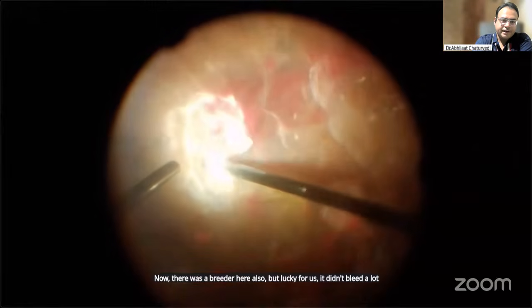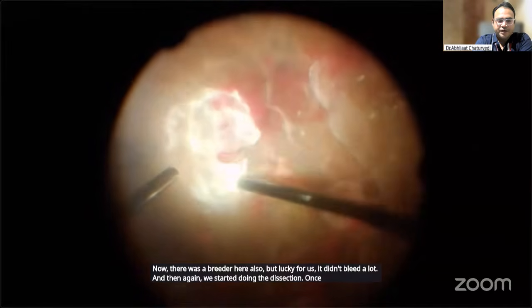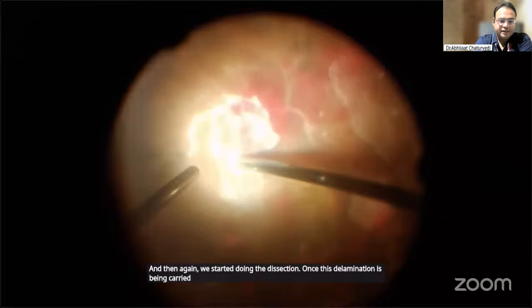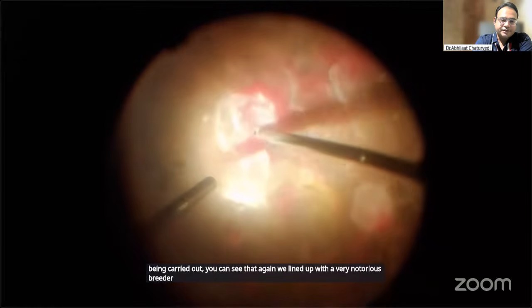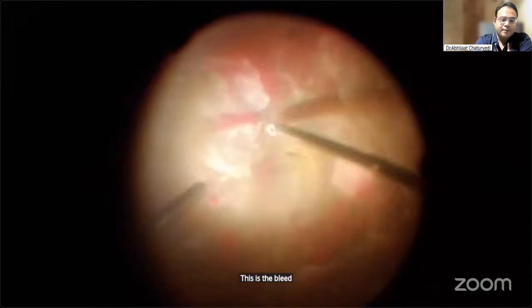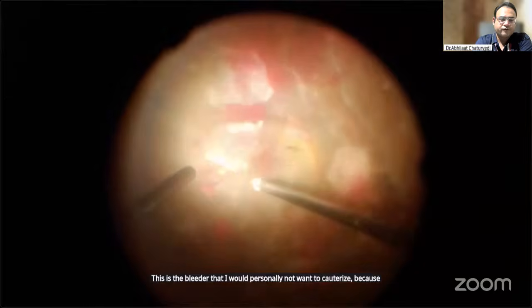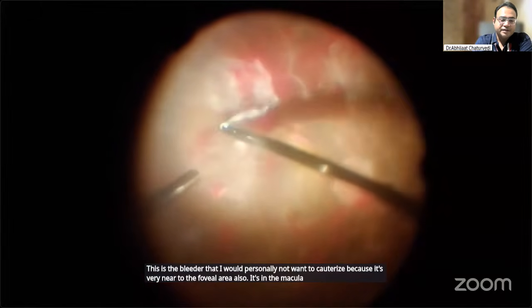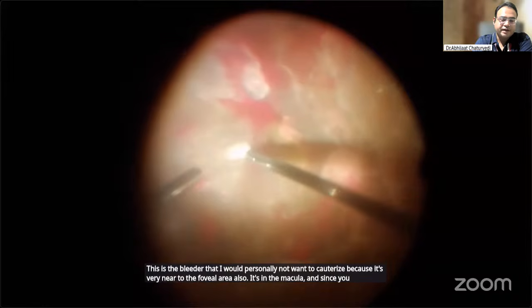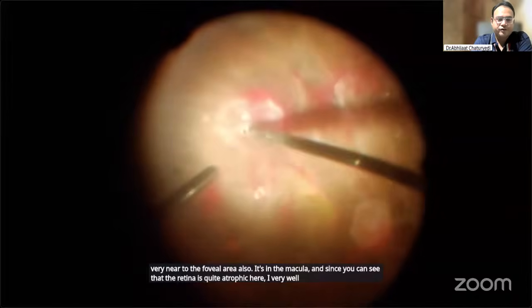And then again, we started doing the dissection. Once this delamination is being carried out, you can see that again, we land up with a very notorious bleeder. This is the bleeder that I would personally not want to cauterize because it's very near to the foveal area also. It's in the macula. And since you can see that the retina is quite atrophic here, I very well may create an iatrogenic break here.